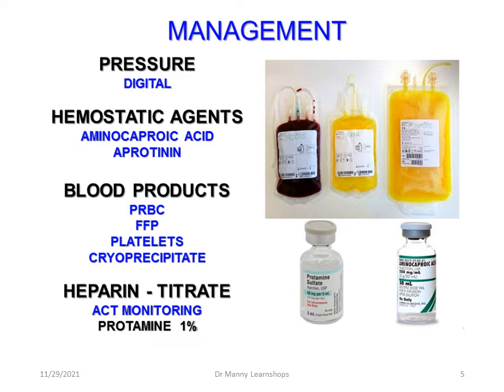Or make sure that you've got heparin monitoring through activated clotting times or activated partial thromboplastin times. Also, you could consider an antidote such as protamine sulfate 1%.